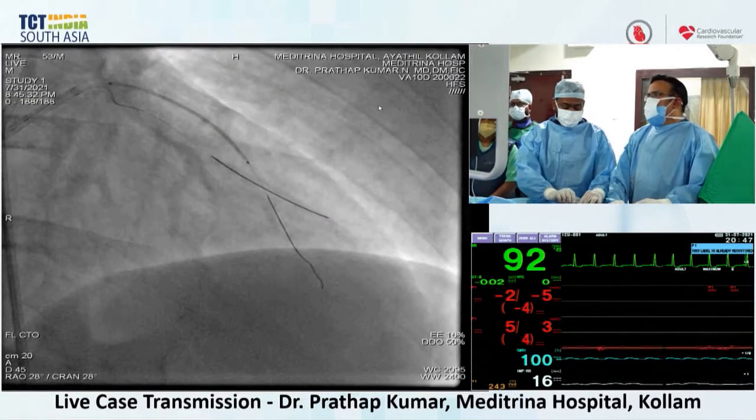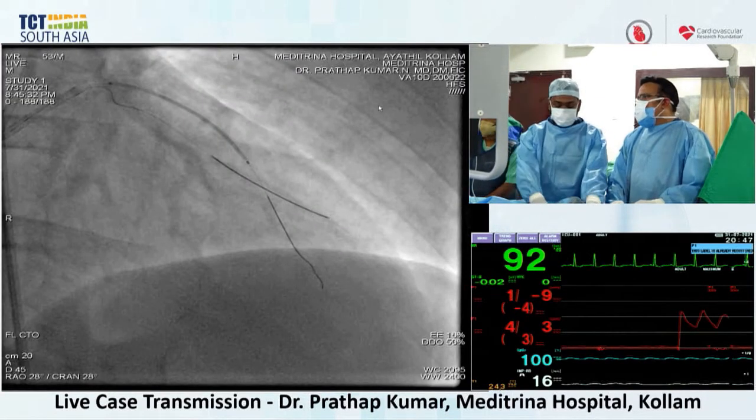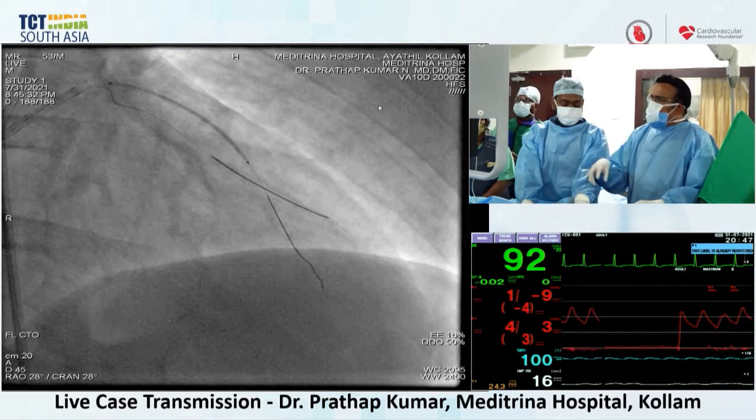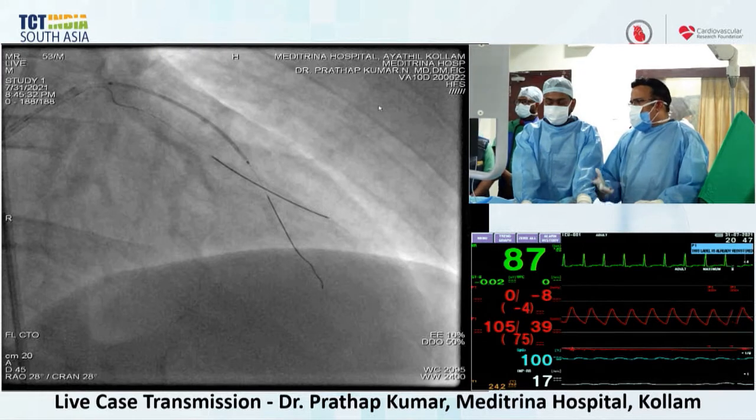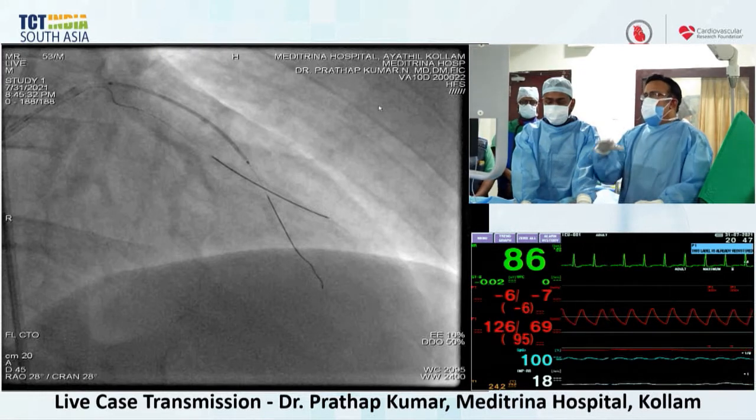Correct. Or any complications. That is one point, Dimitri, but another point is that you may be pushing down some of the material which is in the proximal part, and that creates a slow flow distally. That is also one possibility we should think about in this case.